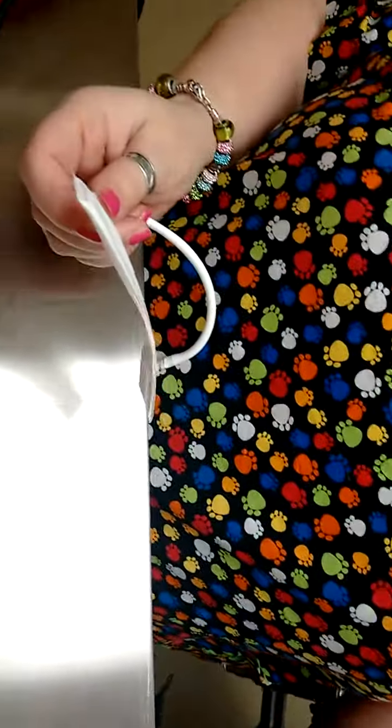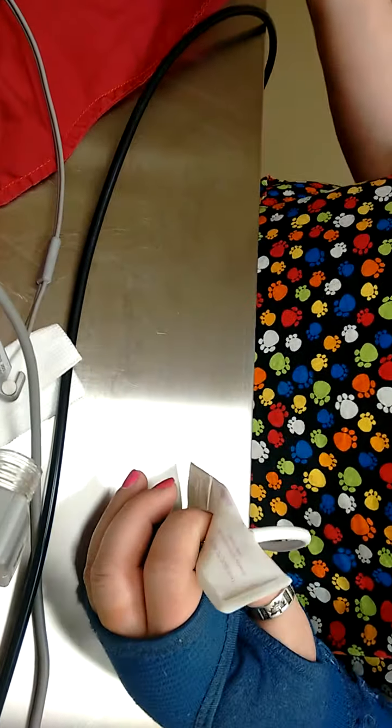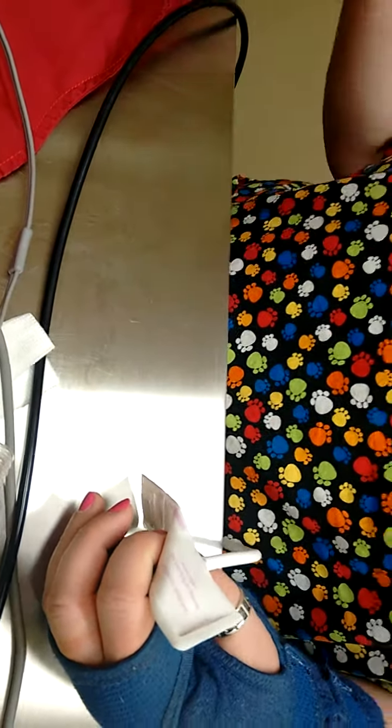You have to remember you can't have the leg tied if you're putting it on, or you have to tie it lower. You can't do it in the leg where you have your vein or your IV, because you're going to disrupt the blood pressure that way. It happened once with me. So you have three legs to choose from. It's better to go up a little bit higher, or if you have a big dog, you can go lower.